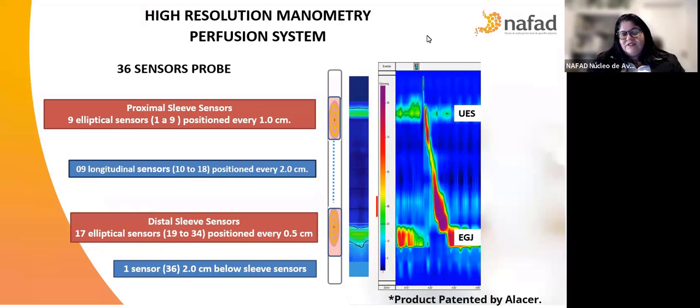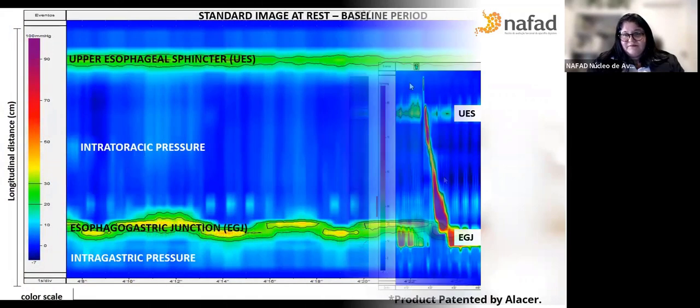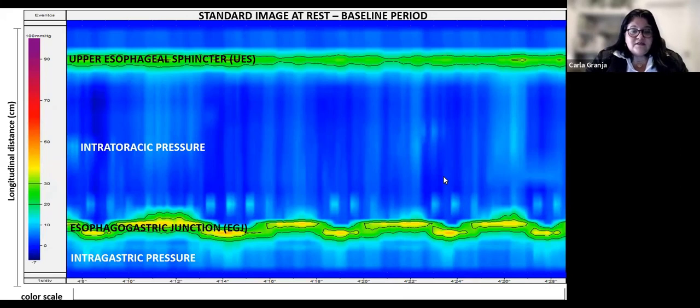Another idea that was great is the fact that, different from the non-perfusion systems, the probe presents an intelligent distribution of sensors. We have here two areas of elliptical sensors positioned in a smaller interval, and it permits to evaluate upper esophageal sphincter and especially esophagogastric junction accurately. So, we can see it's more sensible than probes that have sensors positioned just in longitudinal form. All images presented in the next slides are produced by exams we performed with this device.